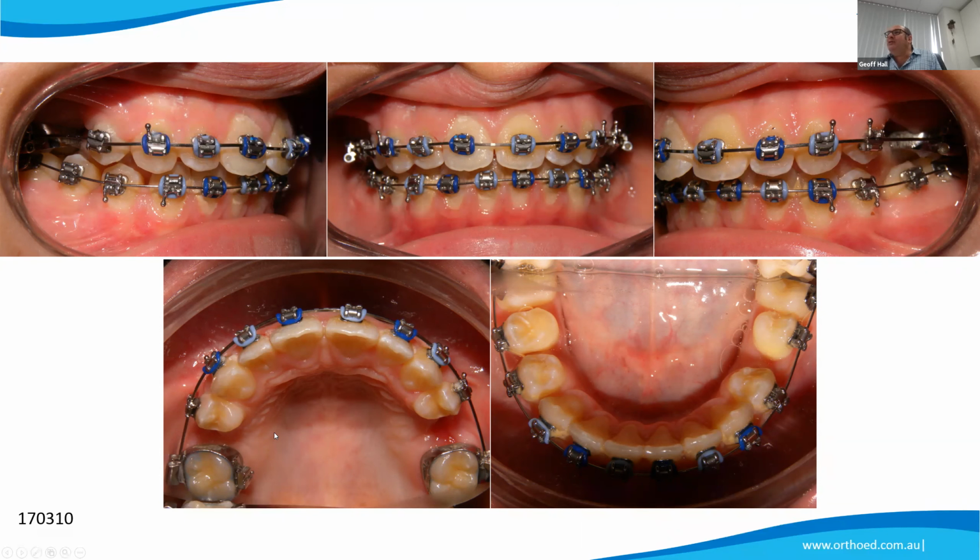Well, no, traditional orthodontics, that's what you would tend to do, which means that not only do you have to expand it, but you have to add buccal root torque to the transpalatal bar as well. Okay, so it just doesn't tip out, but it moves out in a more bodily fashion. Because that way you're moving the root out with the torque, and you're moving the crown out with the expansion process. But we're going to go through all of that in module 7, when we talk about management of open bites, etc.